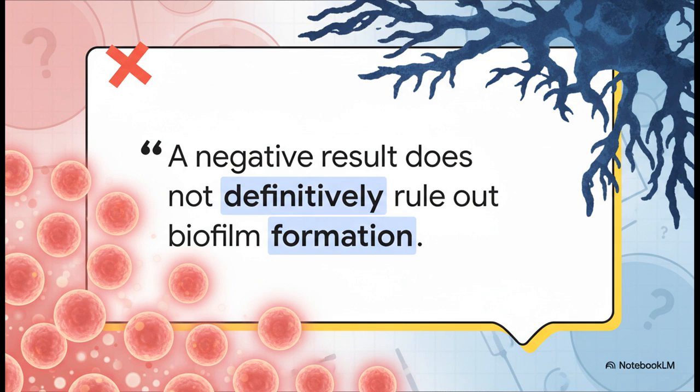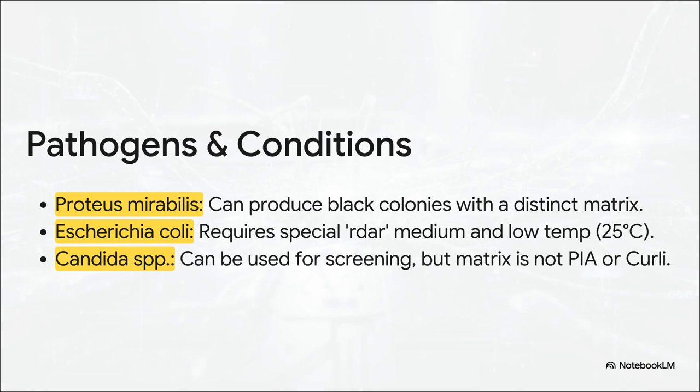And this quote sums up the danger perfectly. For an organism like Acinetobacter, if you get a pink colony, you feel relieved. But that result is essentially meaningless. A negative on this test does not, and I repeat, does not rule out a clinically important biofilm. We cannot make diagnostic decisions based on that kind of uncertainty. It's just not acceptable. And the list of quirks just keeps going.